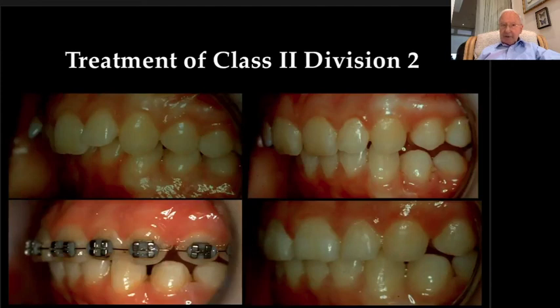The first activation is to turn the sagittal screws to advance the upper incisors. The screws are turned twice a week, once in midweek and once at the weekend. It may be necessary to relieve the acrylic over the soft tissue lingual to the incisors. At this stage, distal occlusion is corrected and the overbite is reducing as the lower molars erupt. The next step is to add brackets on the upper anterior teeth during the twin block stage. This makes an easy transition into an upper fixed appliance to complete the treatment.